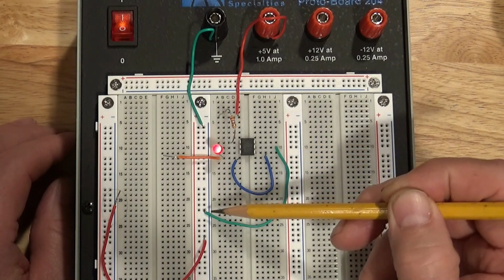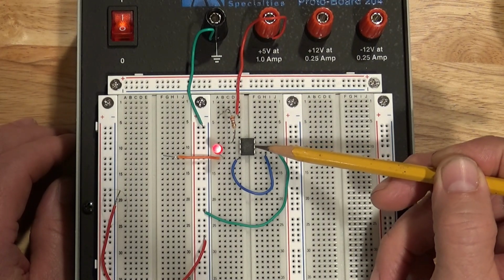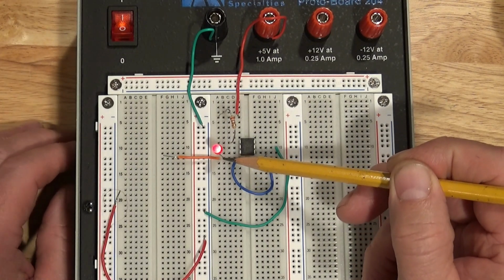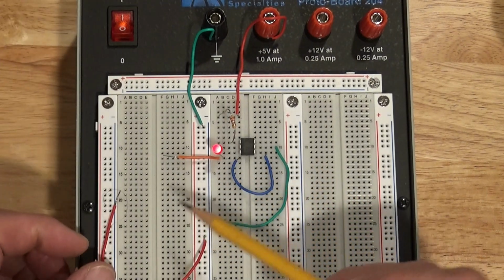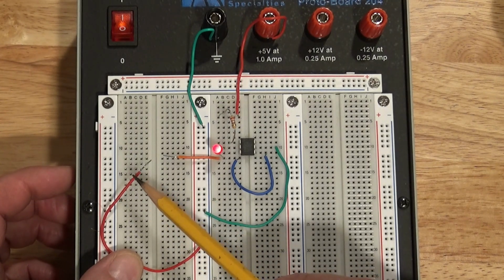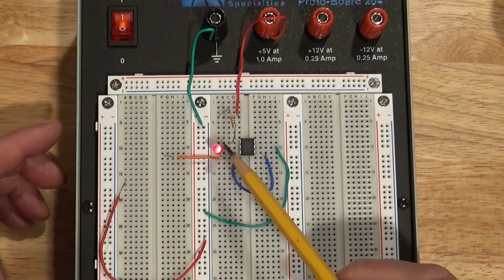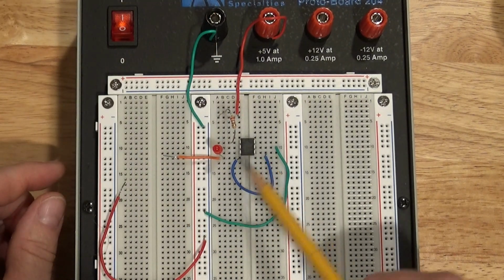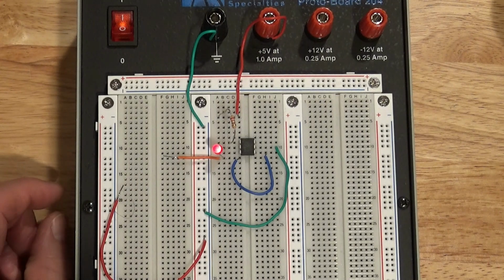And the way this latches is I've got pin 5 here connected to ground. And so when this side of the chip conducts, it basically connects pin 5 to pin 4 with a ground, and that comes around and holds this pin low and makes it stay low until you remove power. And so on the device I've built, there'll be a momentary normally closed switch built into the probe, and once you're done with the information, you simply push the button momentarily and it removes power and the device unlatches, and then you can go and touch another microwire tip and get another channel indication.